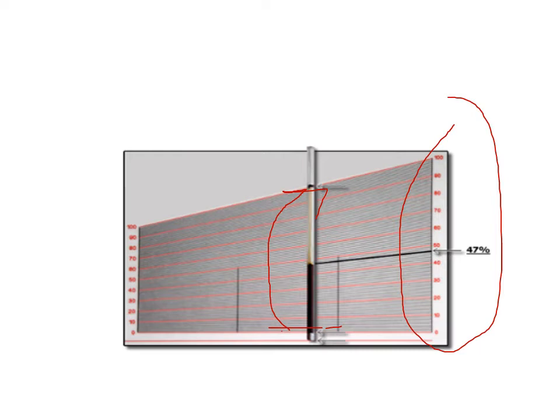The key to this method is accuracy in the placement of the tube. The bottom of that red should be lined up with the 0 line on our grid. Bottom of red on 0. Slide the tube along the grids until the top of plasma aligns with 100. Bottom of red on 0, top of plasma on the 100.